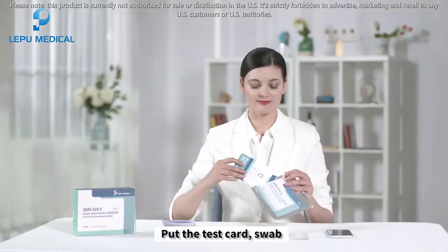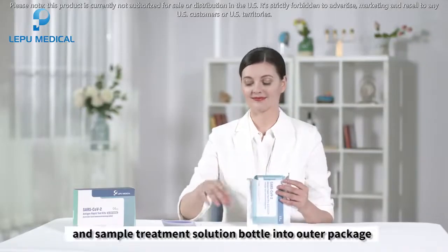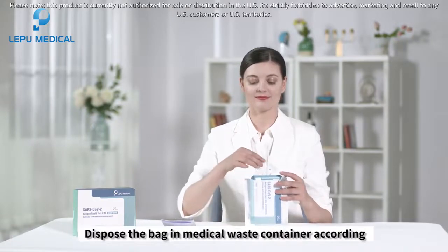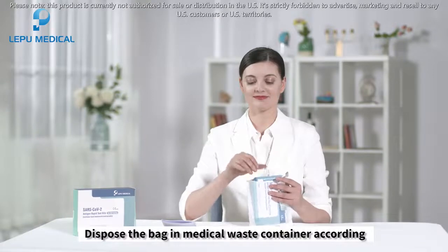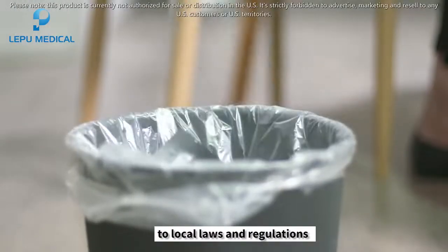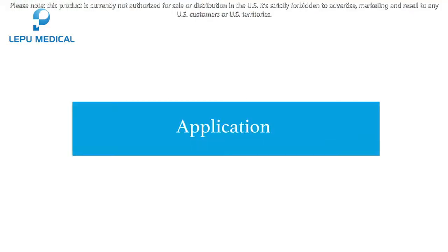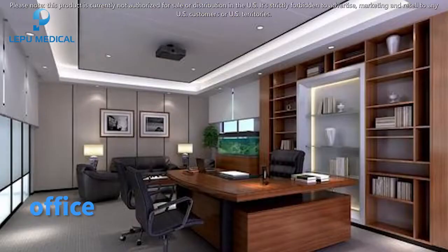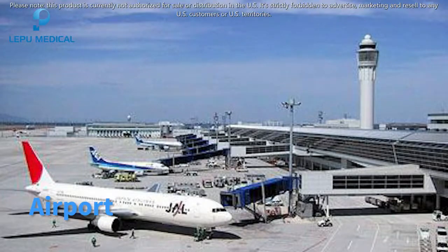After test, put the test card, swab, and sample treatment solution bottle into outer package and seal it tightly. Dispose the bag in medical waste container according to local laws and regulations. Application. The self-testing kits can be applied at home, school, office, corporation, airport, hotel.